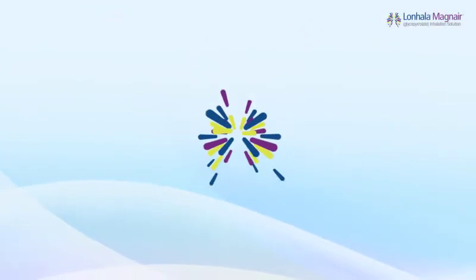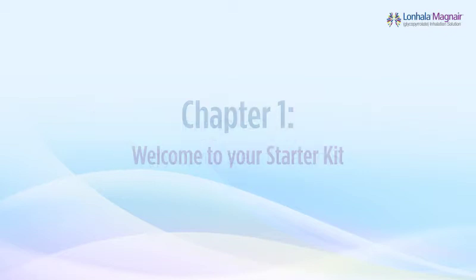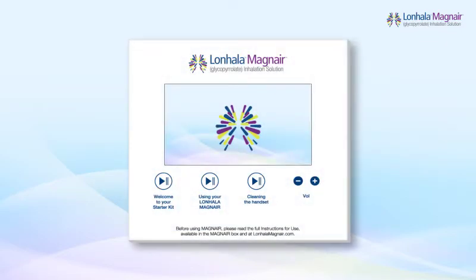Welcome to your starter kit for Lanhala glycopyrrolate inhalation solution for use with the Magnair nebulizer system. Before taking your medicine, please take the time to watch this instructional video. This chapter will review the parts of the starter kit. Pause this video at any time by tapping on the chapter's pause/play button, or jump to a specific chapter by pressing the buttons below.